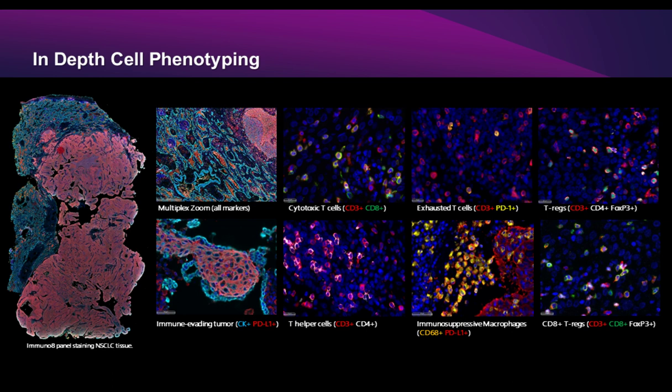Yeah, maybe Scott, you could comment on how much time it typically took your lab to develop a standard 4-plex assay or something using some other type of maybe chromogenic multiplex or other fluorescent platform? Sure, yeah. I mean, we do a chromogenic. Generally, as I mentioned in my presentation, we don't go above too much because then the chromogens can blend and it gets more difficult to deconvolute the signal from one another.